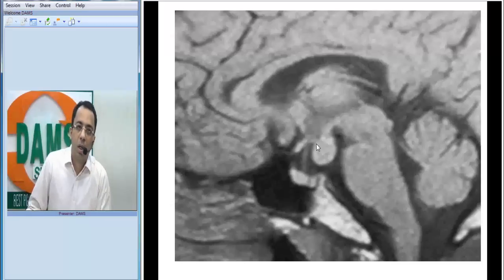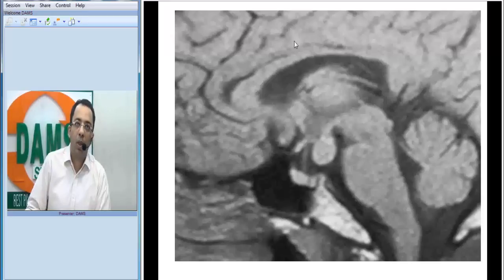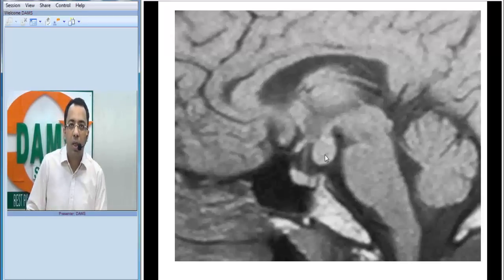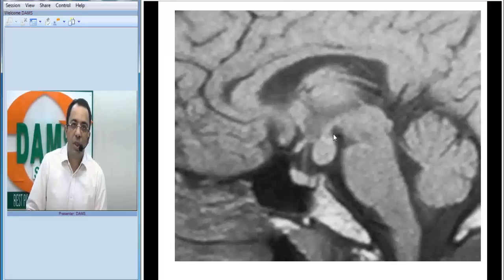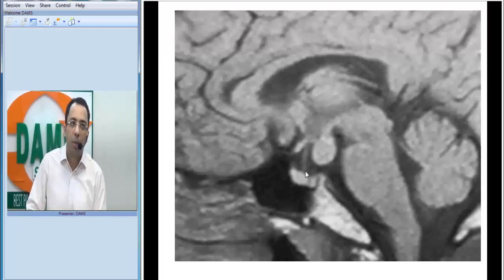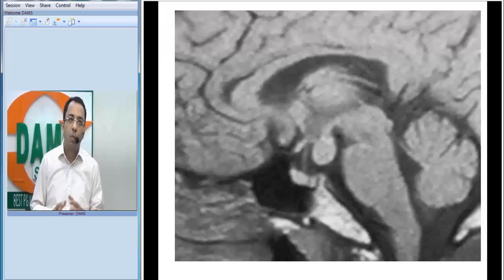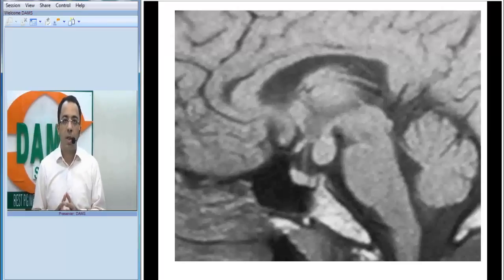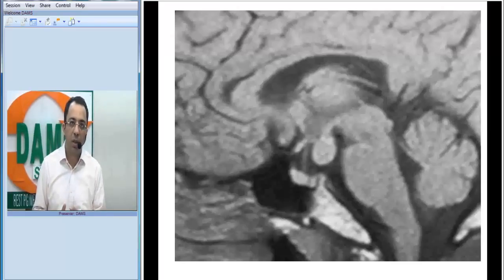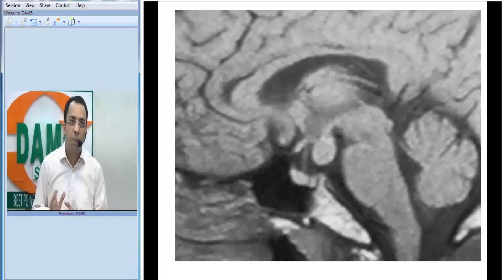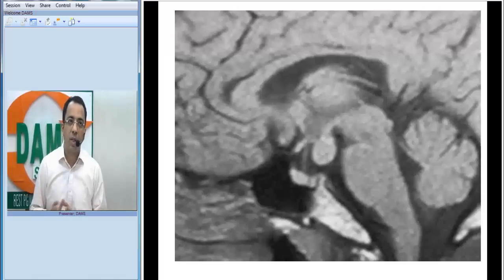This is a T1-weighted image and this lesion looks iso-intense to grey matter. You can see a pedunculated lesion in the area of the tuber cinereum, which is between the mammillary body and the infundibular stalk, iso-intense to grey matter on T1-weighted image. Although we don't have a contrast-enhanced image right now, this lesion was non-enhancing. So the summary is: an iso-intense lesion to grey matter in the area of the tuber cinereum, in a patient with precocious puberty, which is non-enhancing.